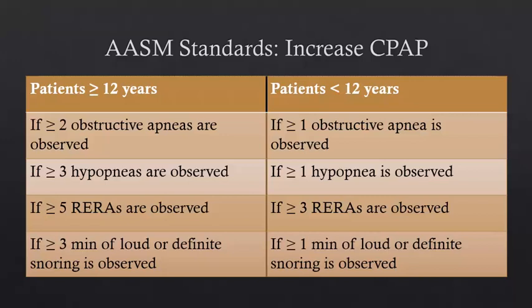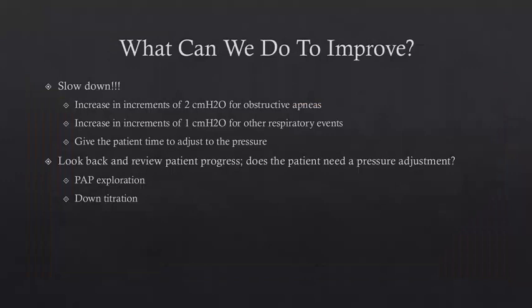However, I want to make note that recording by the minimum standards shouldn't give pride and doesn't necessarily ensure a satisfactory test. Sometimes the minimum standards set forth for us as technicians provide barely adequate fulfillment of our responsibilities to not only the patient, but also to the referring physician. So what can we do to improve?